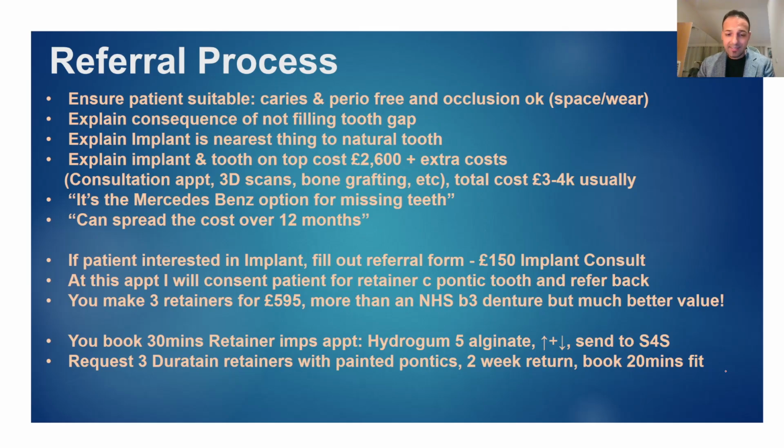Ask them for a painted pontic. There are options to add an acrylic tooth within the retainer. These can come loose and they won't fit as well. I prefer it when they paint the pontic. You can buy pontic paint, well, the lab can. You can buy it yourself, of course, but you want the lab to do all the work on here. So ask them to paint the pontics and not to place a tooth pontic. You need to specify that.